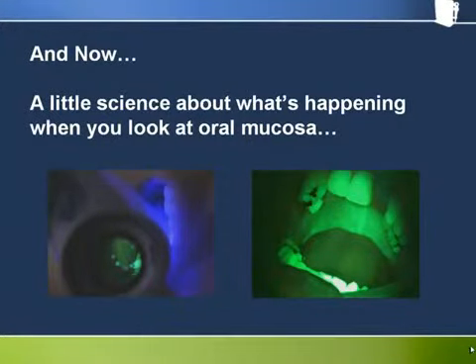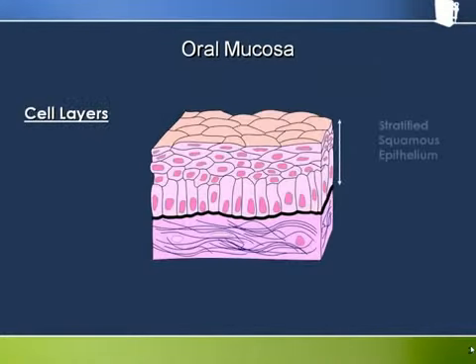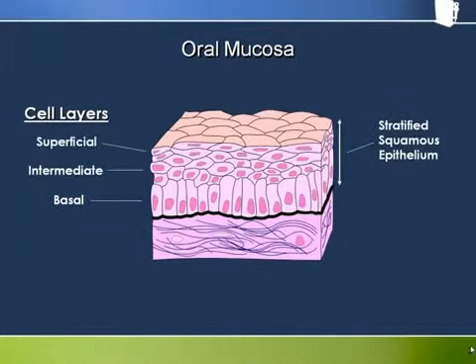Now let's spend a little time trying to understand the science behind fluorescence visualization of oral mucosa. How does it work? Before we go any further, let's first remind ourselves of some basic facts.